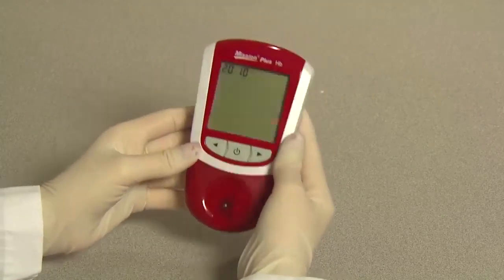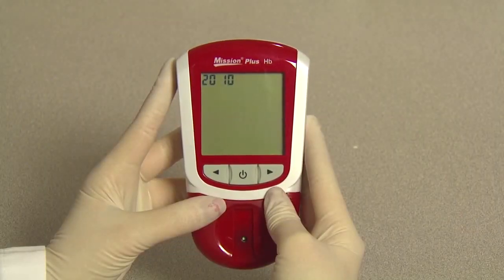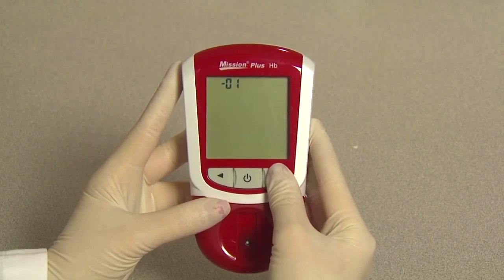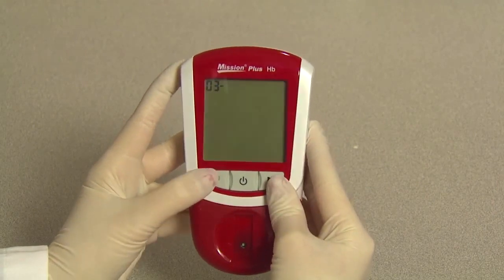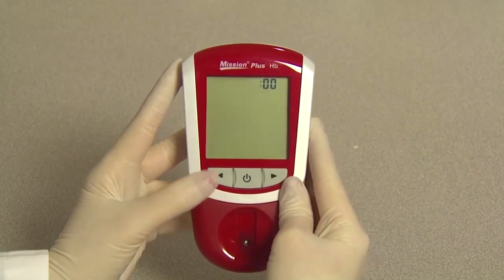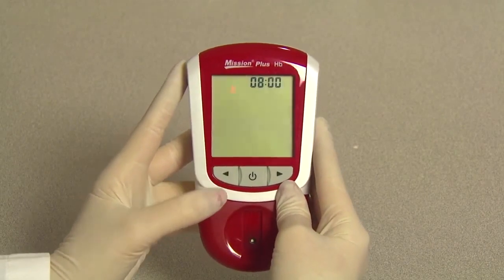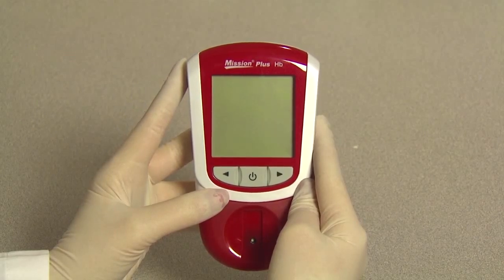The meter will automatically turn on after the batteries are inserted and will enter the time setting state. Press the right or left button to adjust the meter time setting of the year, then press the power button to save. Press right or left to choose the correct month, then press the power button to save. Press right or left to choose the correct date, and then press the power button to save. Press right or left to choose the correct hour, press the power button to save, and then proceed to choose the correct minutes. Press the power button to save the setting. After that, the meter turns off automatically.